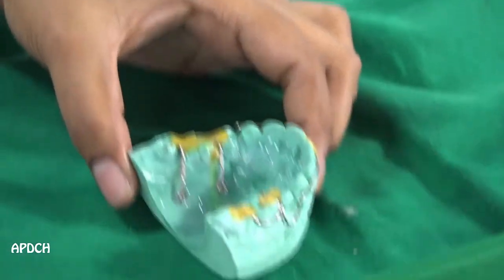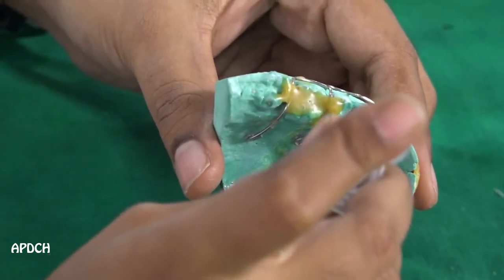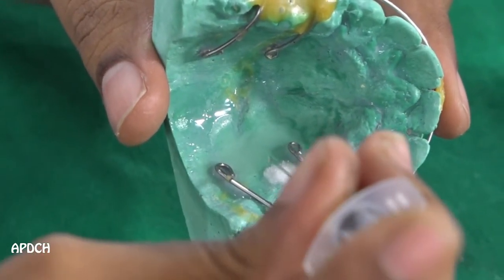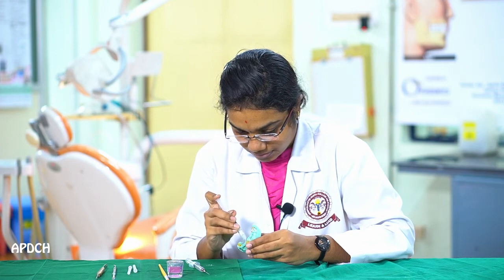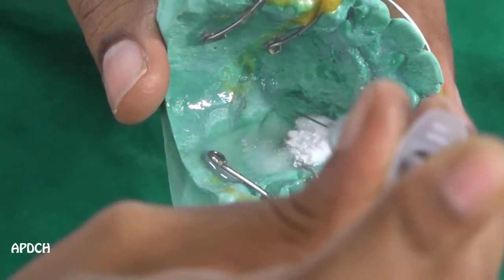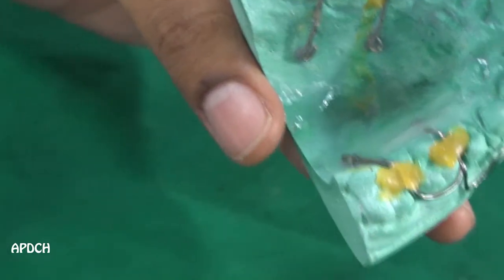Now we have to apply the polymer and monomer using a syringe. I use the sprinkle-on technique here. First, we put the polymer with the syringe, then the monomer is poured, and again the polymer is poured on the surface. We have to complete the full appliance this way.